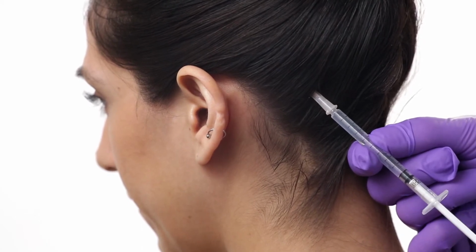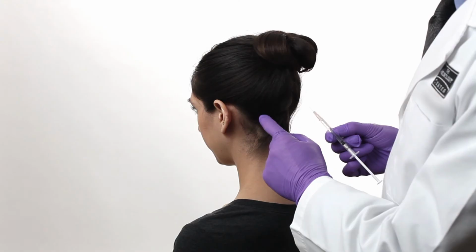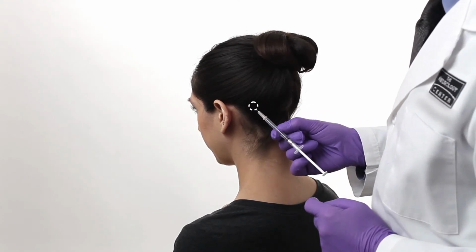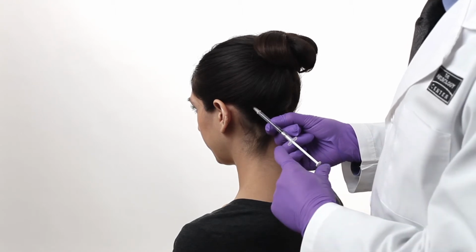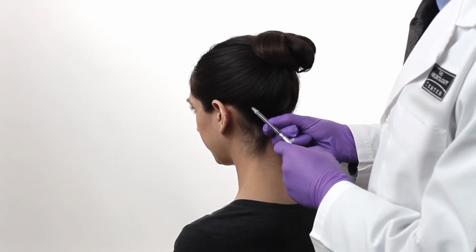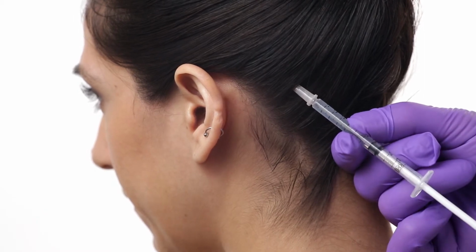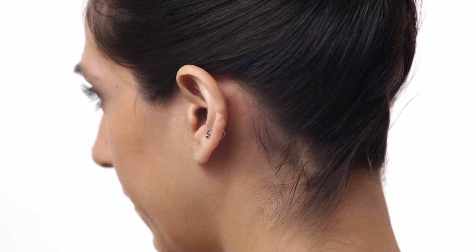Then inject Botox superficially. For the second injection, measure diagonally 1 to 2 fingers breadth up and out toward the tip of the ear at the 10 o'clock position. Stabilize the hub of the needle, again with the bevel of the needle facing up, and make the injection.